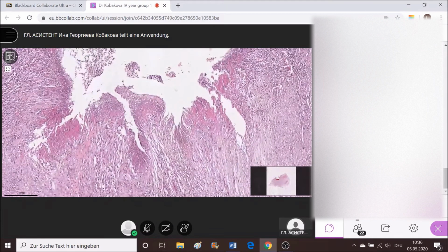What type of necrosis is that? Take a look at it. Amorphous, pinkish, looking like a specific protein, but it's actually a combination of two. What type of necrosis is observed at the base of the stomach ulcer?